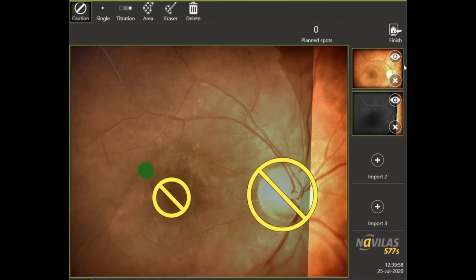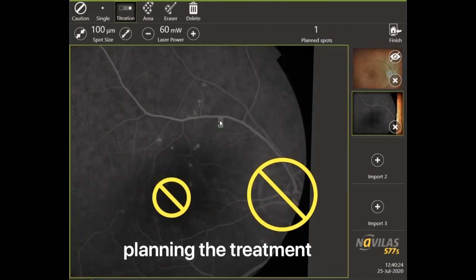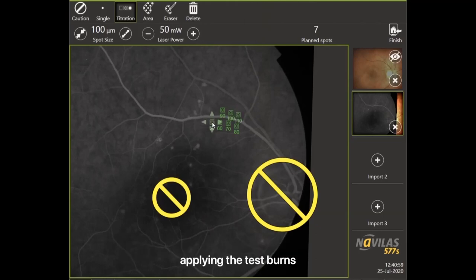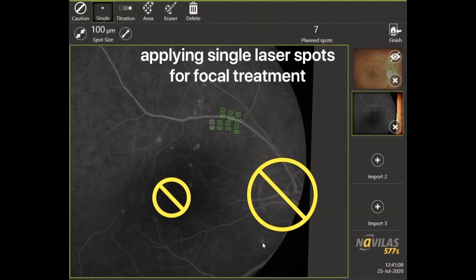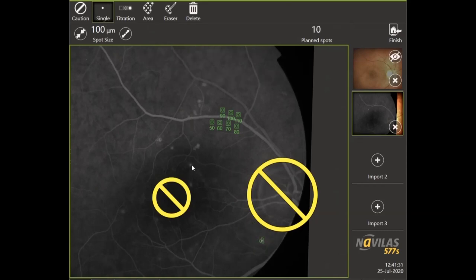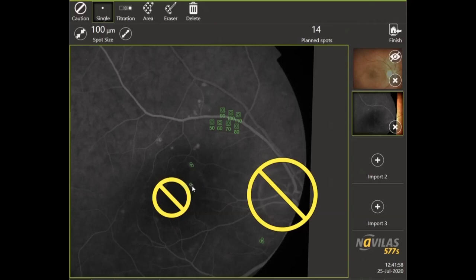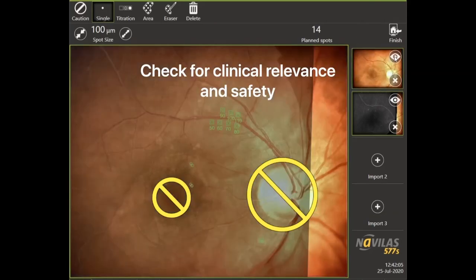After placing caution zones on the optic nerve head and a 500 micrometer zone from the center of the fovea, planning of test burns was performed. Two or three 100 micrometer laser dots were applied on the spots of leakage on the fluorescein angiography image. Then we checked the clinical relevance of the laser plan to anatomical zones of the fundus image.